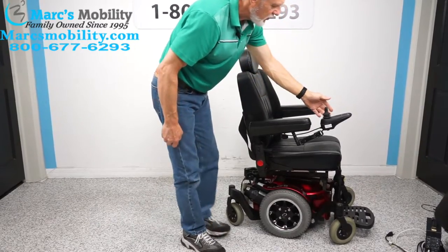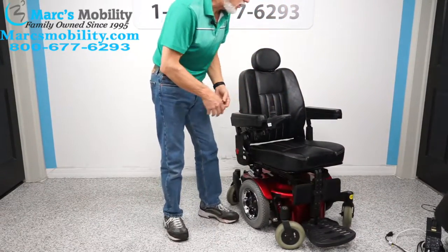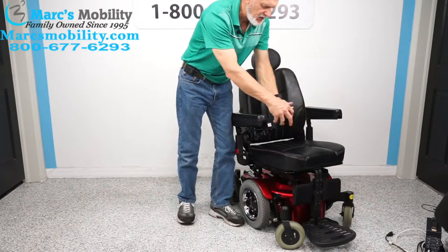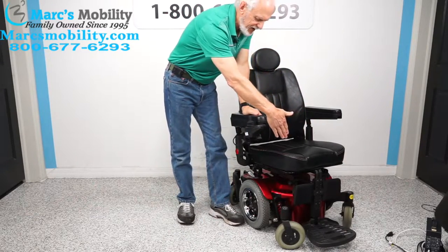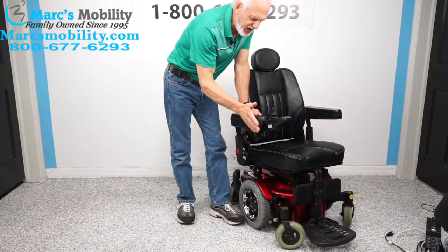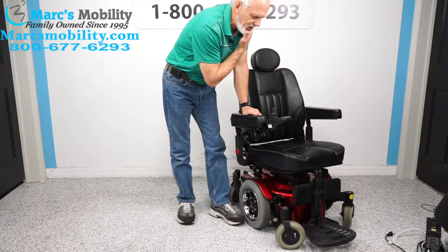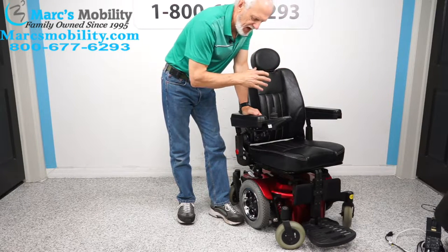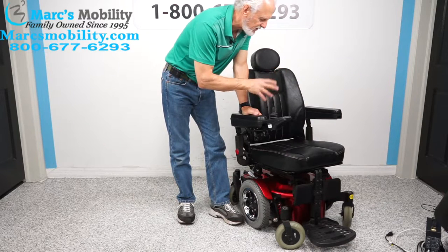Let's turn the power back on. You also have what's called a swing-away joystick — you can move the joystick and gain about four or five extra inches to get closer to a dining table. If you're left-handed, we can switch the joystick to the left side. We're not going to change the seat on this chair because it's too expensive.